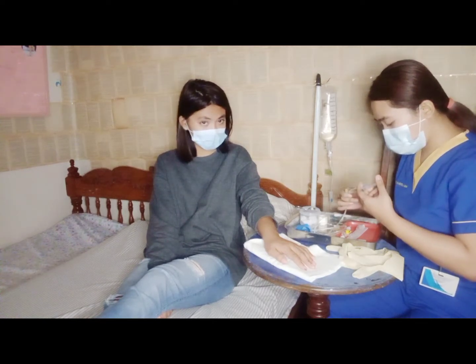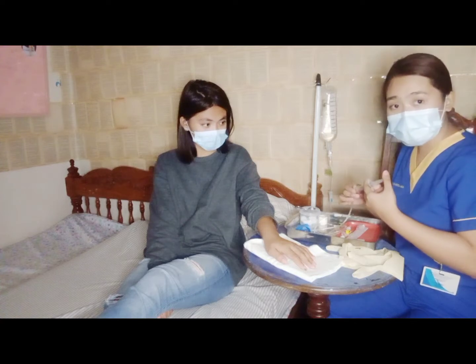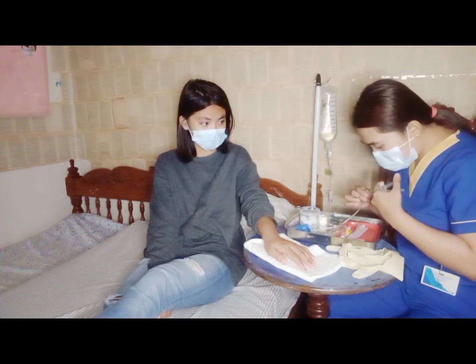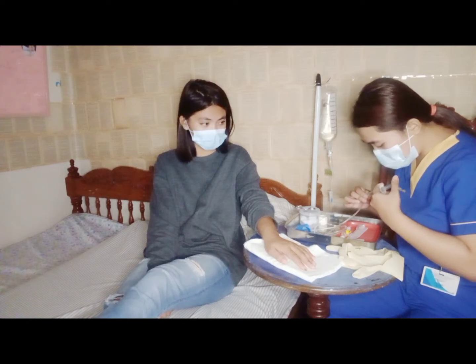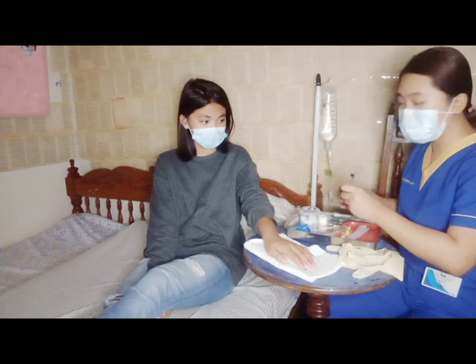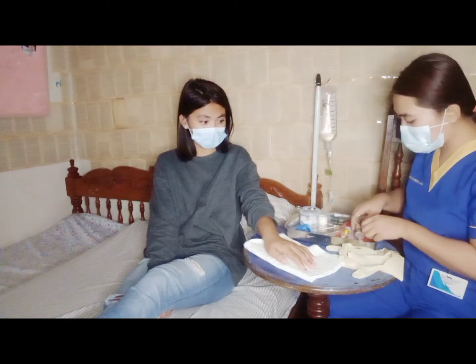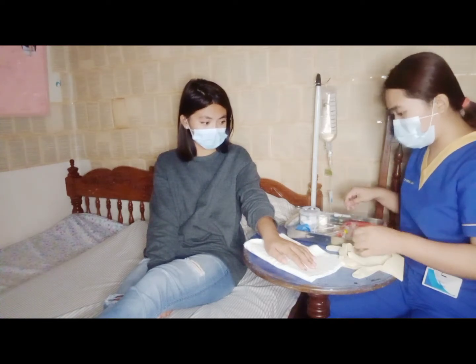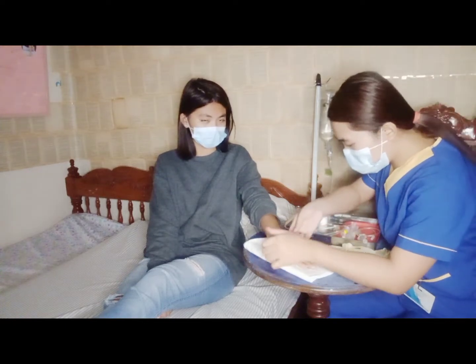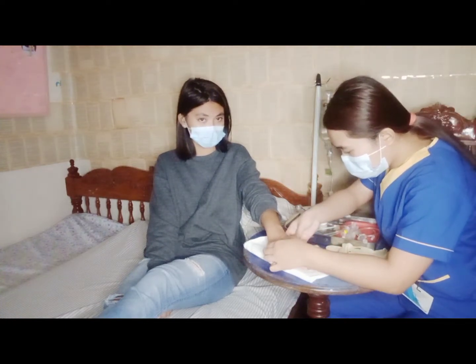Okay. And then, flush it until the saline or the tubing is filled with the saline. Okay. And then, we will reserve it for later use. Okay, so, let me observe your hand, ma'am.